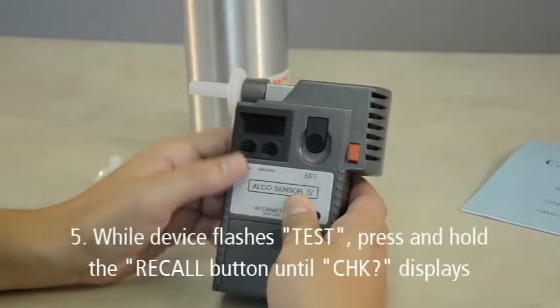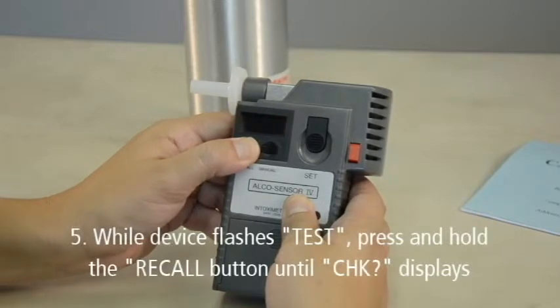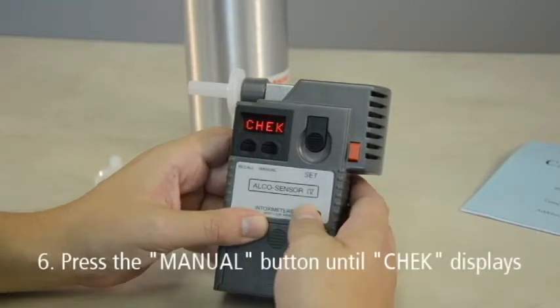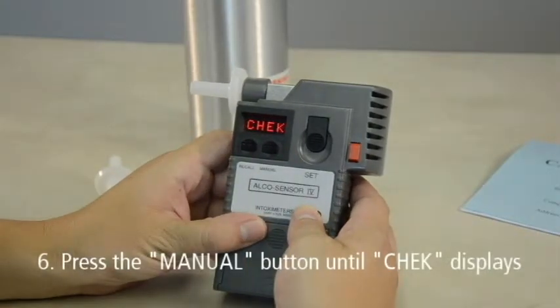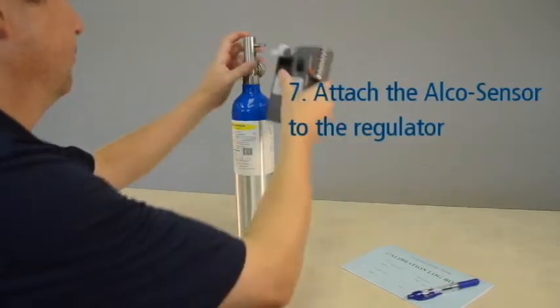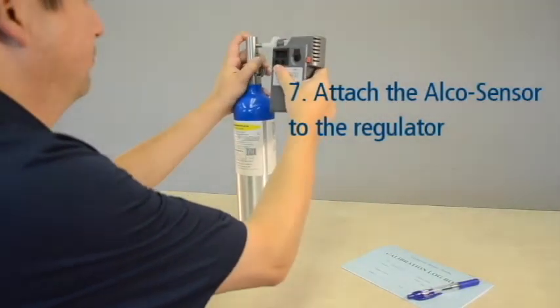While the display is flashing TEST, press and hold the RECALL button until CHK? displays. Then press the MANUAL button until CHEK displays. This puts the device into accuracy check mode. Now attach the Alkosensor 4 with Memory to the regulator.